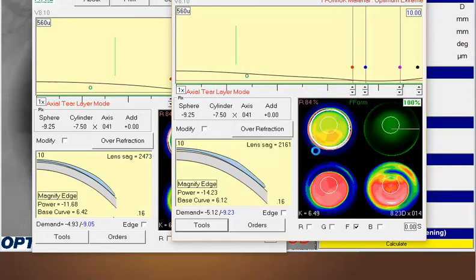And then to continue, what that'll do, it'll adjust the power of the lens to be closer to that diagnostic lens. So that gives you a little extra data. And where that's helpful is on these, as you know, with these difficult corneas, sometimes the optical numbers just don't make sense. And so that gives you another way to check the endpoint, or the general endpoint of that contact lens.